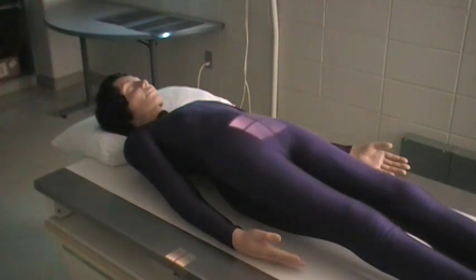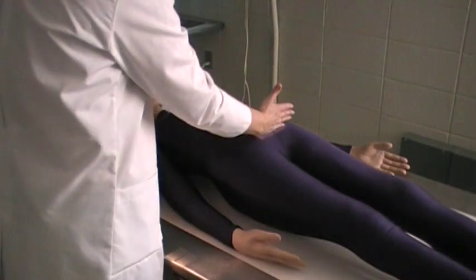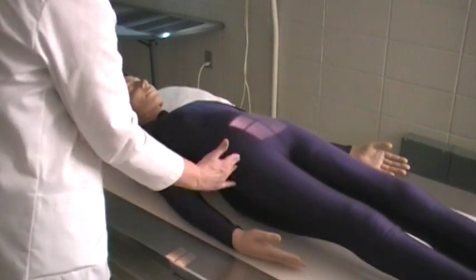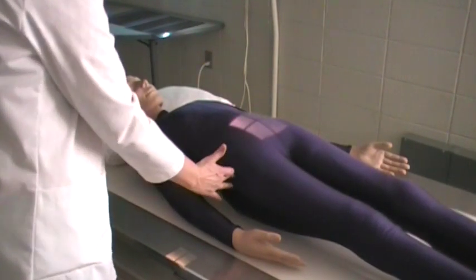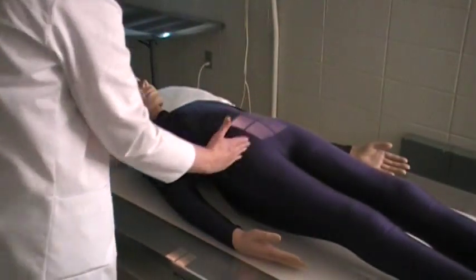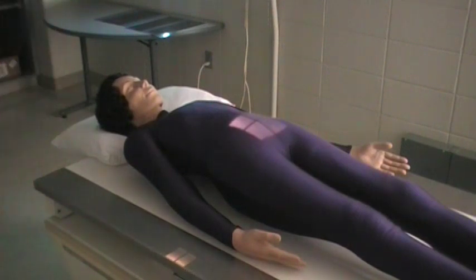One other thing to remember regarding locating the landmark of the pubic symphysis: you can use the prominence of the greater trochanter — it will be at the same level. That is our AP axial of the coccyx.